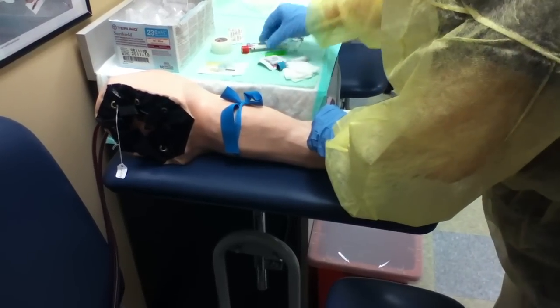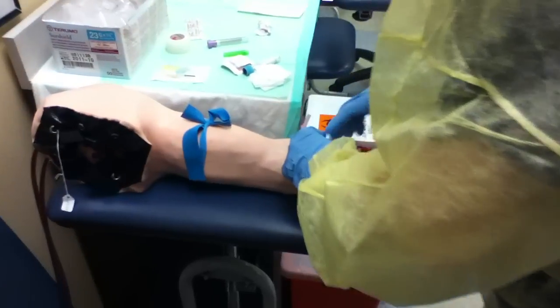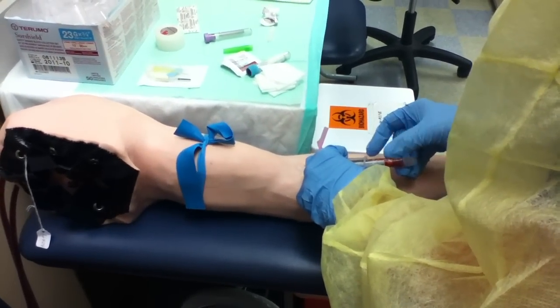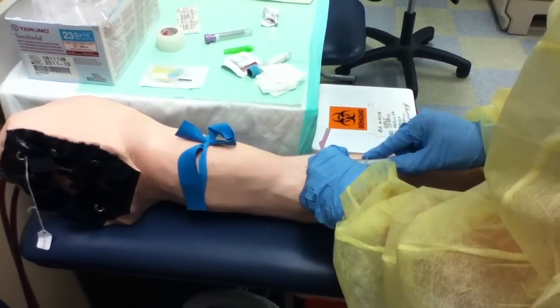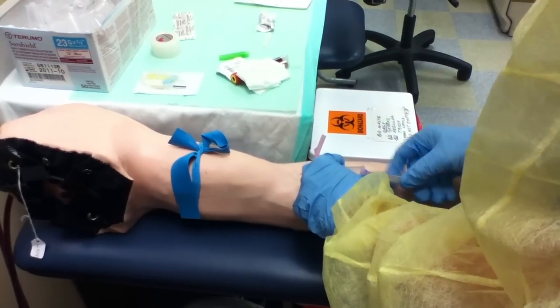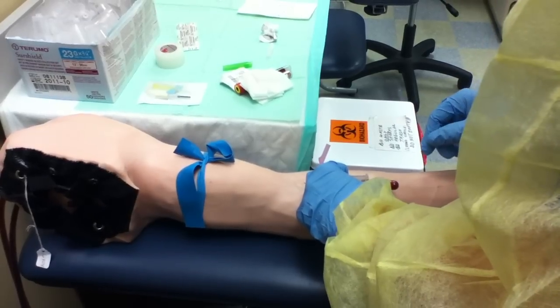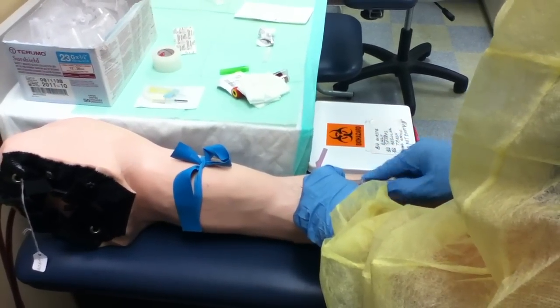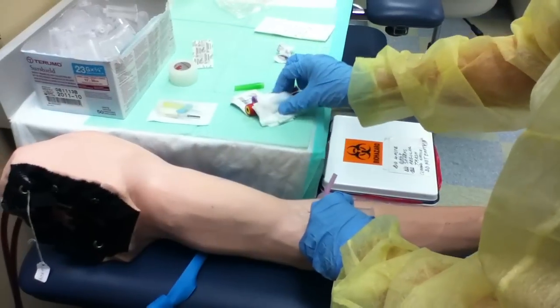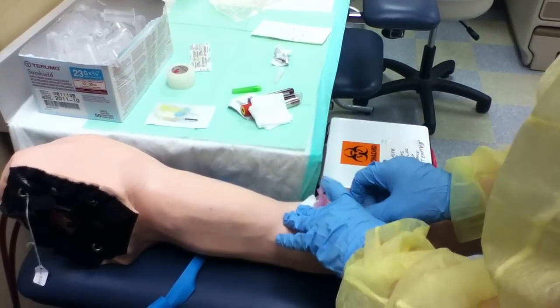You're going to take your tubes out and put the SST tube in. You do that in the middle of the blue and the CBC so that the additive doesn't get in there. After you're done, you're going to take the tourniquet off.